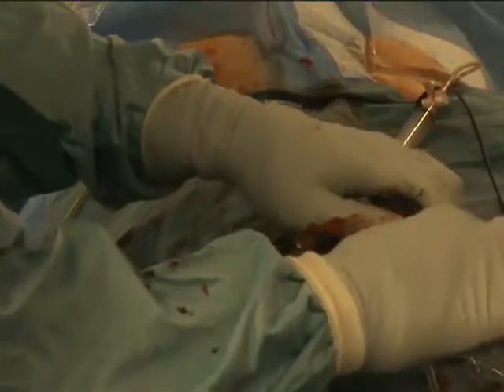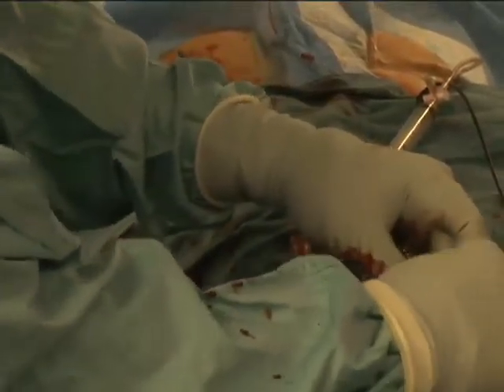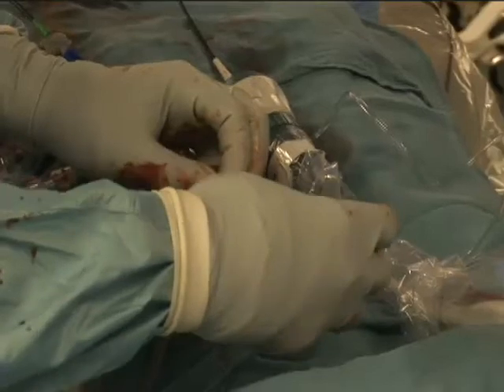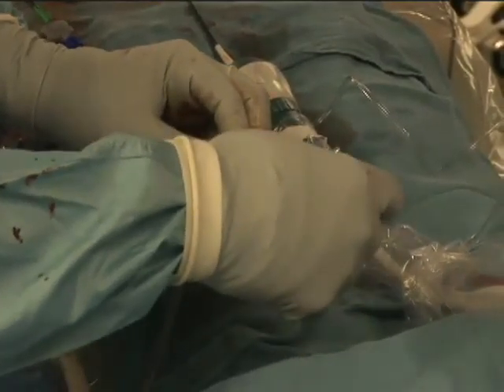The device is then introduced into the delivery sheath and advanced across the atrial septum under fluoroscopy. It is then delivered into position. Its position is confirmed with ultrasound. The device is unscrewed from the delivery catheter, and the images show the catheter disconnect from the device.